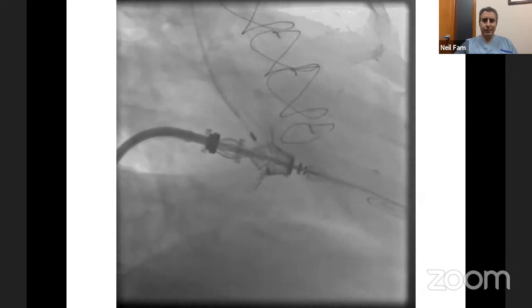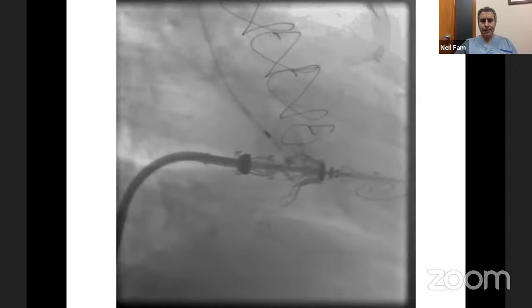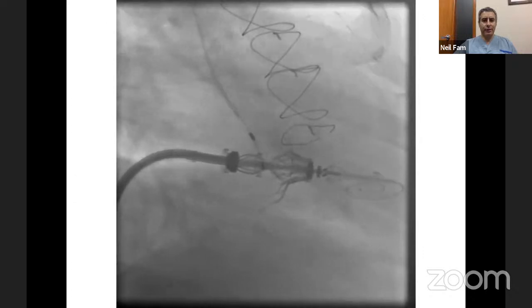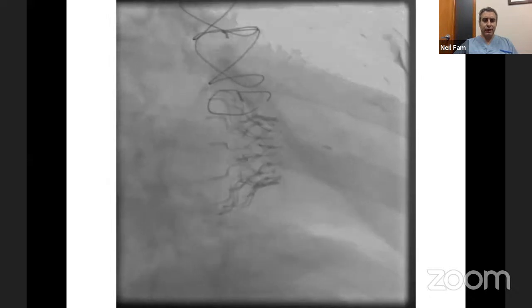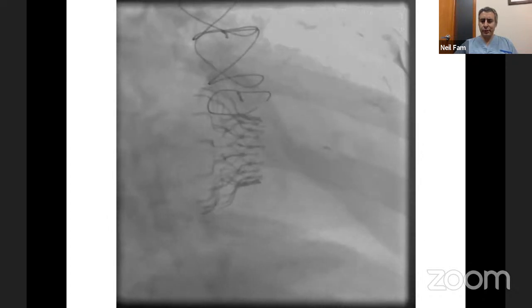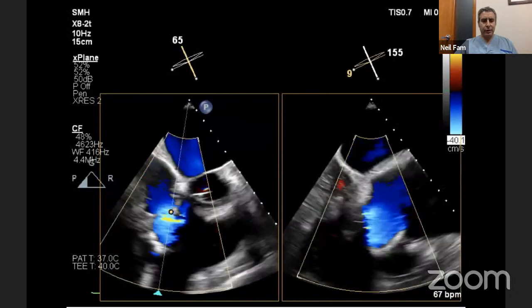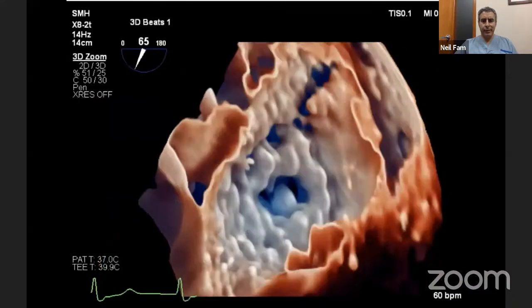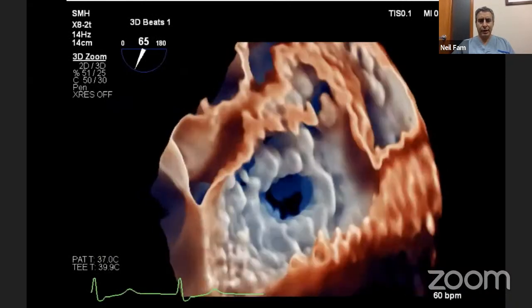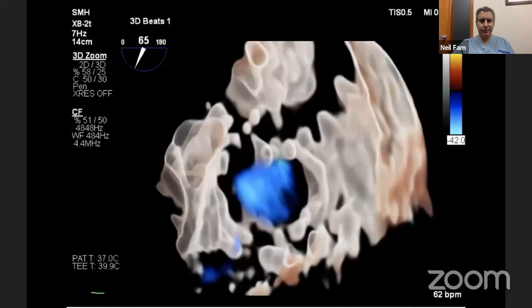And so grasp the leaflets, and then deploy the atrial flange and deliver the valve as shown here. So the procedure went very smoothly. It's quite a fast procedure. As you'd expect, it completely abolishes the TR. There was no PVL, no heart block. And we got some pretty 3D echo images, again, showing no PVL.